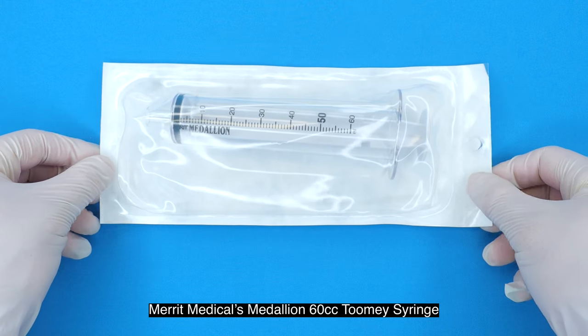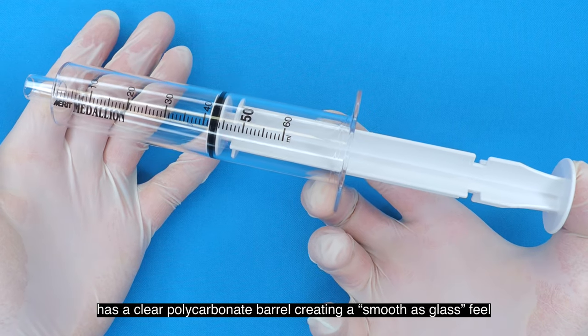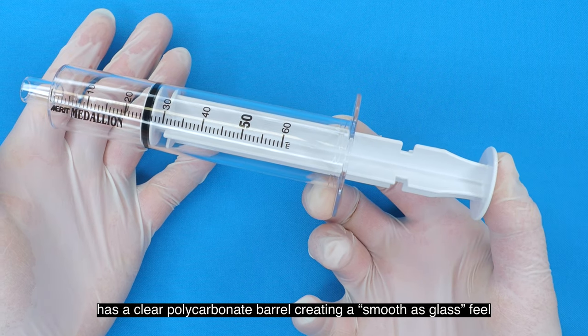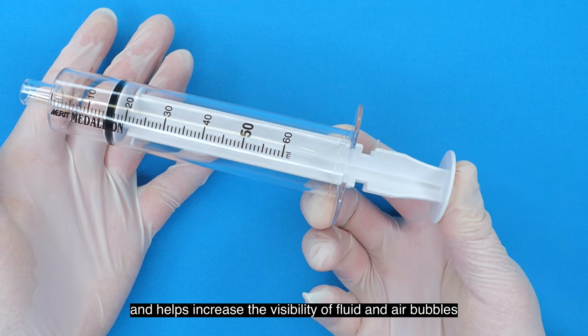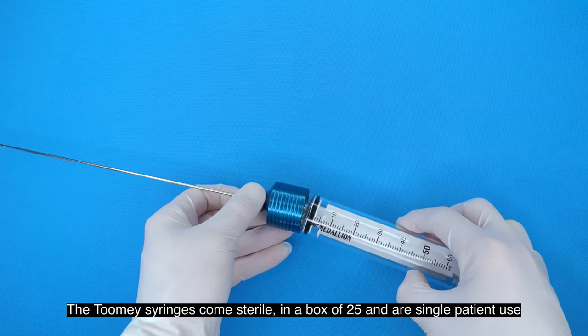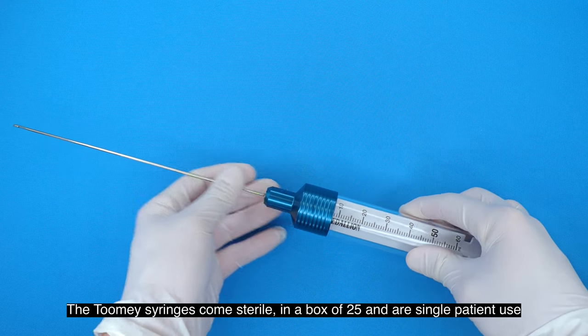Merit Medical's Medallion 60cc Tumi syringe has a clear polycarbonate barrel, creating a smooth-as-glass feel and helping increase the visibility of fluid and air bubbles. The Tumi syringes come sterile in a box of 25 and are single patient use.